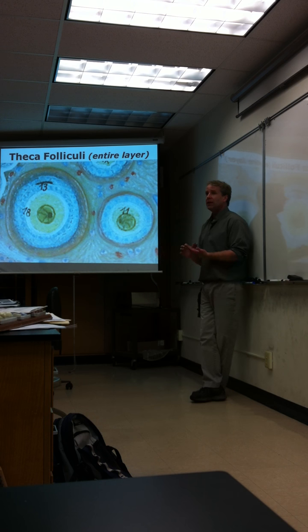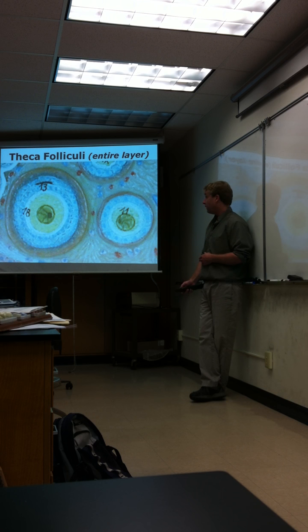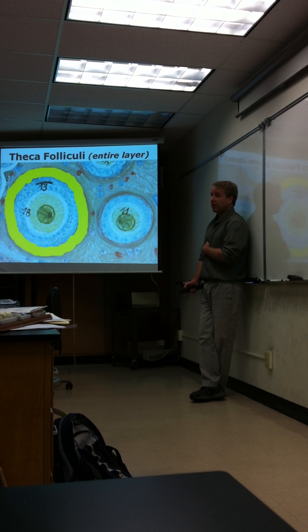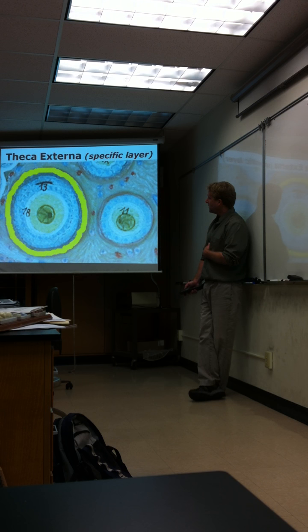Another function is that it helps nourish the follicle. Those are the functions I put over there for the theca folliculi. Again, you can just put interna and externa together and say theca folliculi. Everyone okay with that? I try to simplify that a little bit. In the microscope, you'll see that the interna and externa are kind of hard to see.